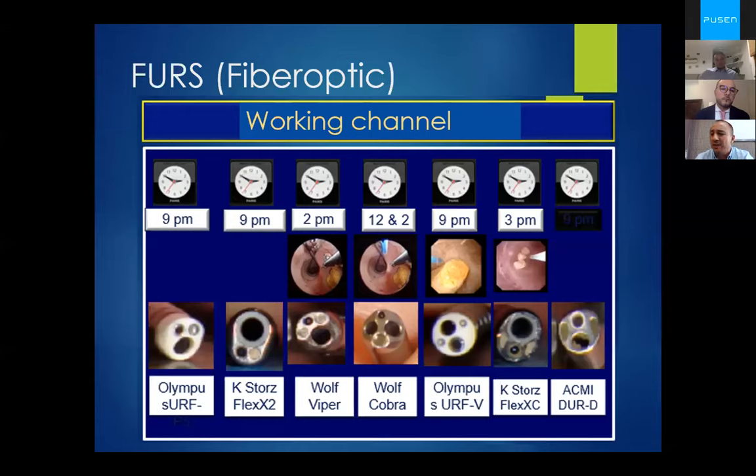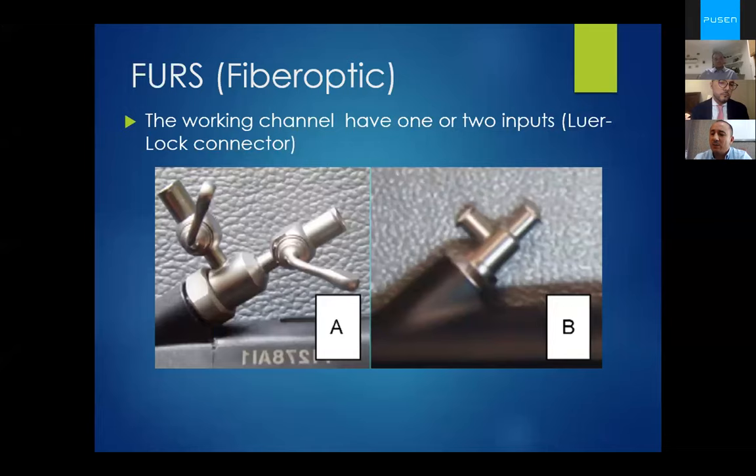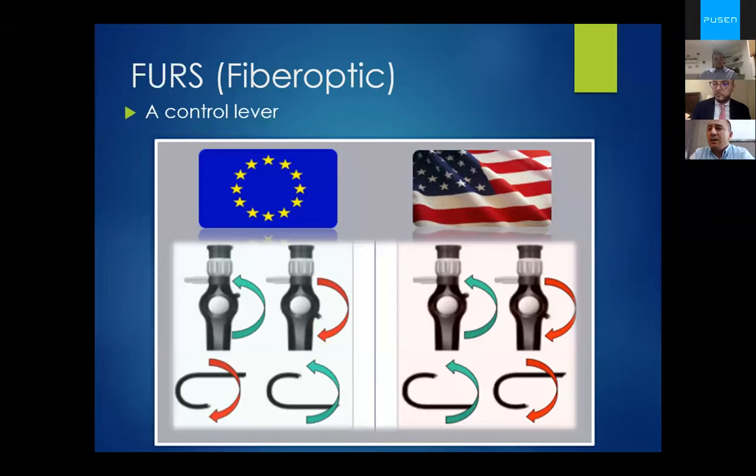The position of the working channel varies depending on the company. This can have repercussions on the procedure, but I think the surgeon must adapt to all working channel positions, like we see here in the picture. The working channel has one or two inputs, Luer lock connectors, for connecting an irrigation and passing an instrument at the same time. A control lever allows deflection movements, but the direction of the movement differs between Europe and the United States, like we see here.